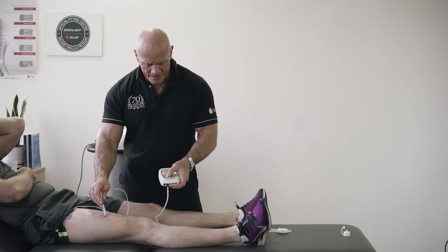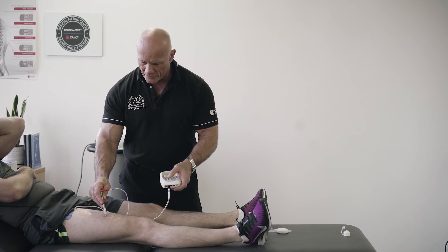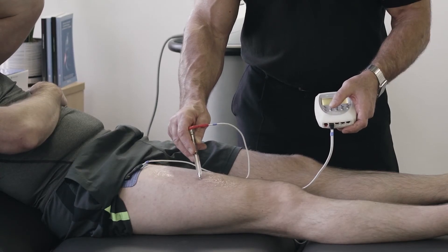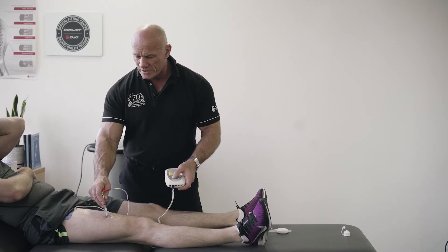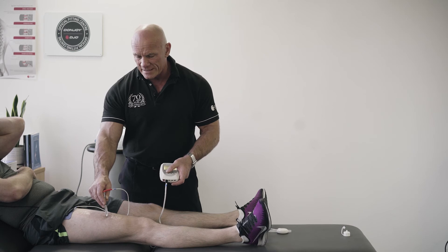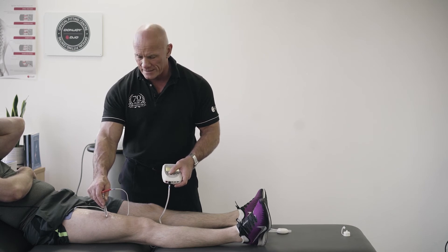The lower the number I have, the more specific I can be, so I just reduce this to three. As I move the pen away it stops, and as I move it back over the point it comes on. You'll see that with this patient we're finding the motor point in the distal third of the muscle — vastus medialis.